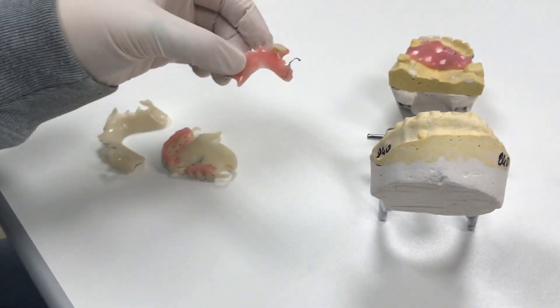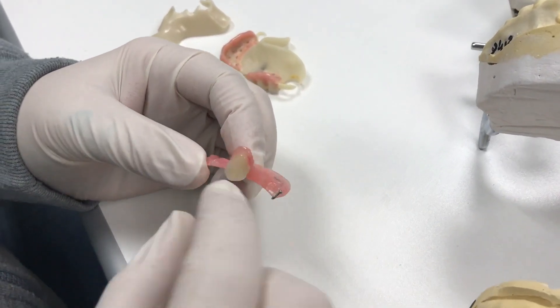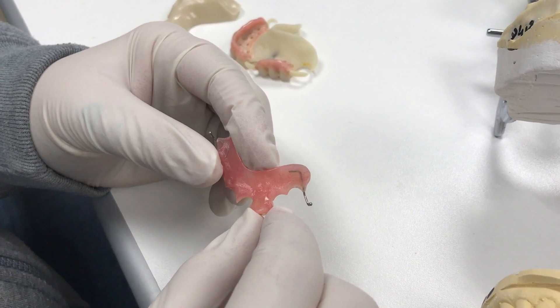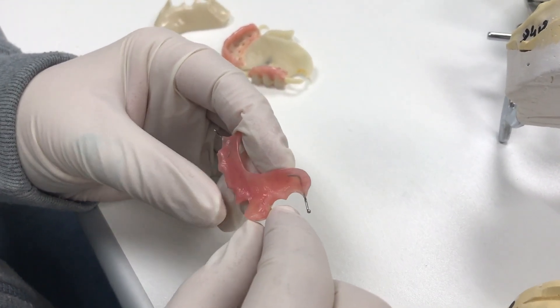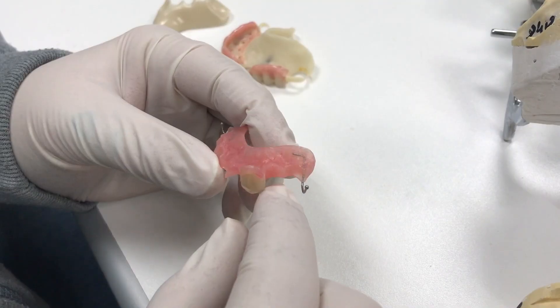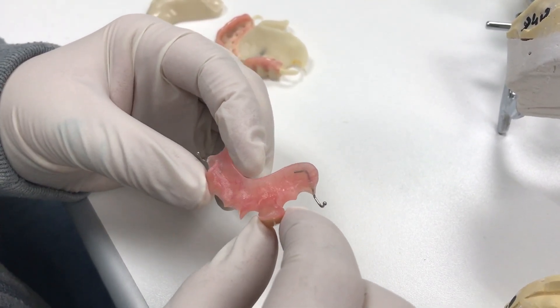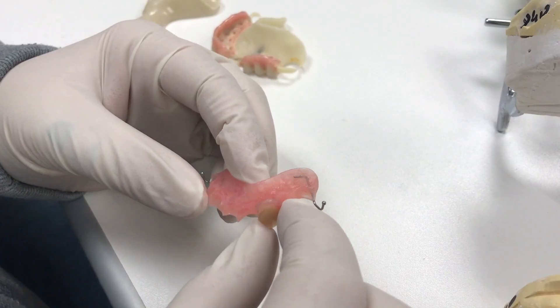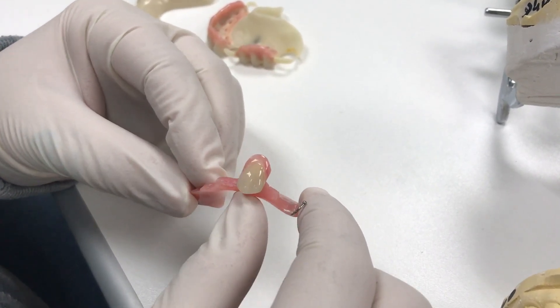So why would you use that instead of something bigger? This is for temporary use — like for an implant, if they're doing a single tooth implant and just need it until they get their healing cap off and go to restore the implant crown. This can be a temporary appliance. We've had people stay in them for years, and they could be used just while implants are healing during those stages.